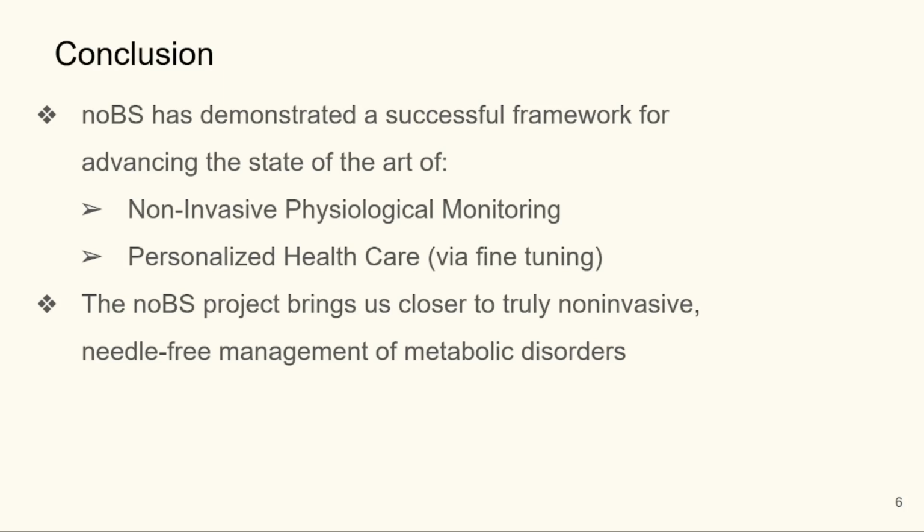Though this prototype is not a ready-for-market device, it is our hope that the NoBS project will be an instrumental piece in advancing the field of non-invasive physiological analysis and in making strides towards truly needle-free treatment of chronic glycemic disorders.